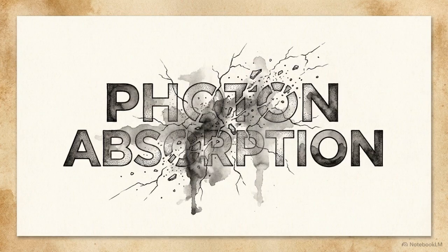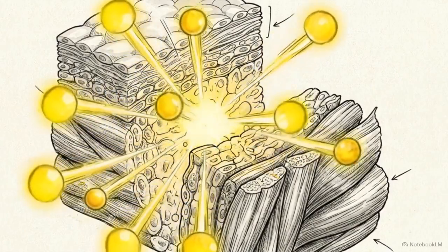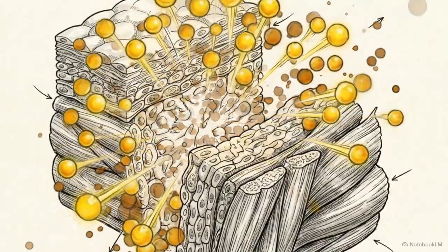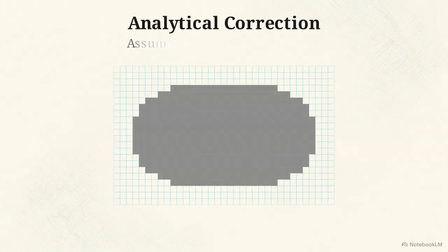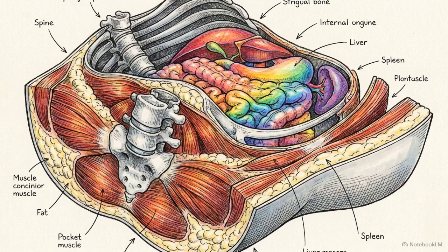Even with optimal collimation and filtering, emission physics still faces one major physical distortion: attenuation. Photons emitted from deep inside the body are routinely absorbed or scattered by the dense surrounding tissue. This artificially lowers the measured pixel counts in the central regions of the final image. Software algorithms attempt to correct this by assuming a uniform rate of attenuation across the body, but human tissue isn't uniform, leaving these calculations inherently inaccurate.